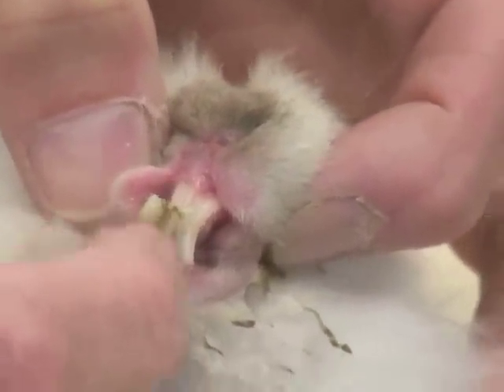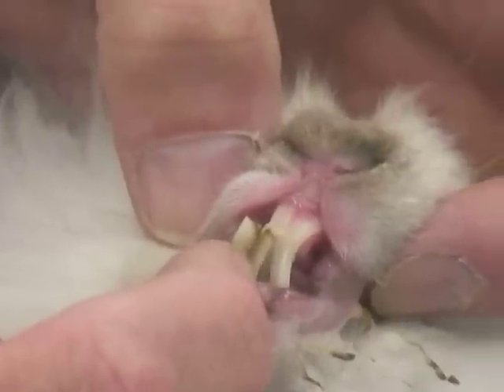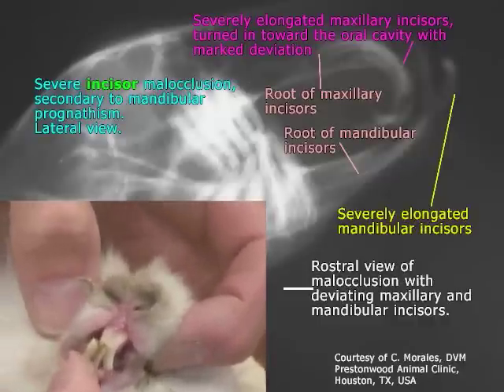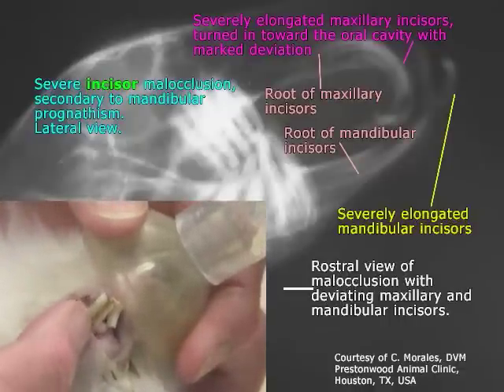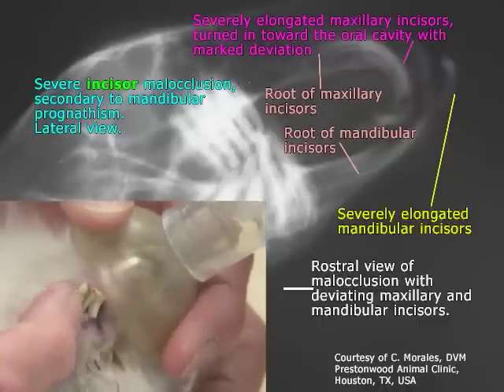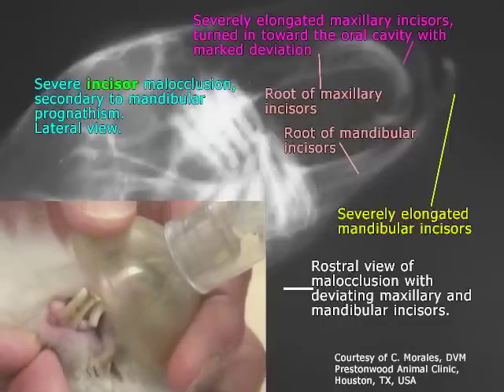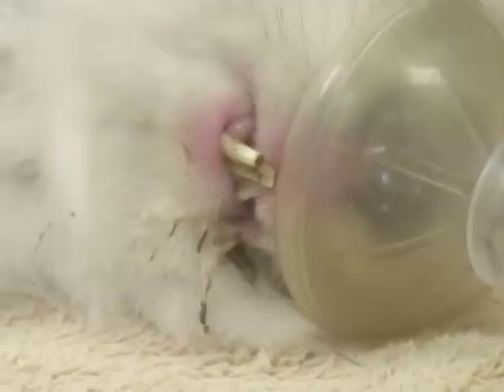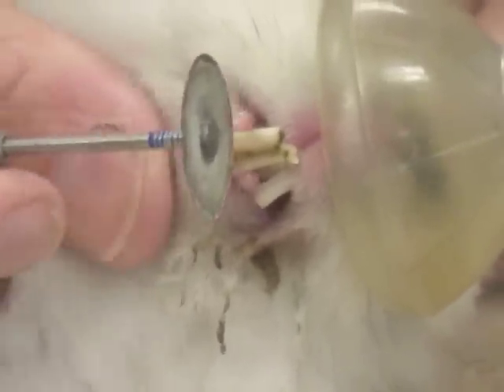These are the lower incisors and these are the upper incisors. You can see that they're not meeting at all. The lower incisors are protruding too far forward and the uppers are behind them. As a result, there's no grinding surface occurring, and because rabbits' teeth grow continuously, they get very long. At some point they just can't even open their mouth wide enough to get food in — these teeth are doing really no function. She can't really grind carrots or blocks of wood with those because they don't meet. We're going to trim those off as the first thing we do here. We have a little cutting wheel that we use to do that, and we're going to cut these off pretty short because they're not really functioning in any way.